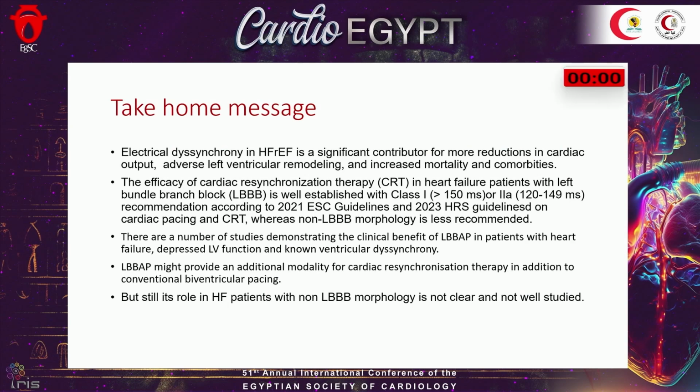My take-home message: electrical dyssynchrony is a significant contributor to reduced quality of life and increased mortality and morbidity in patients with heart failure. Up to now, CRT is the sole effective therapy in this type of patient, and we can consider that left bundle area pacing may provide an additional modality for cardiac synchronization therapy alongside CRT. But its role in patients with non-left bundle branch morphology is not clear and not well studied. Thank you.